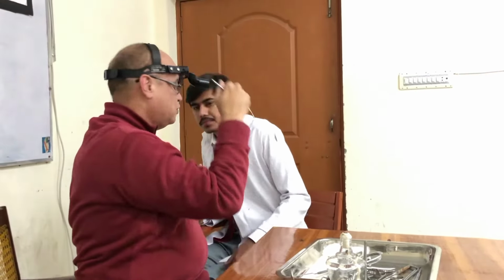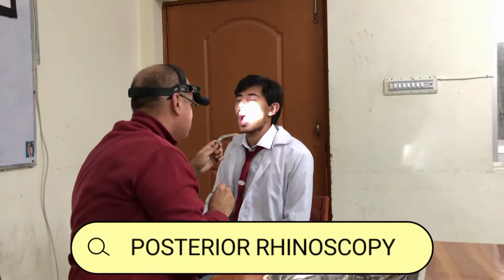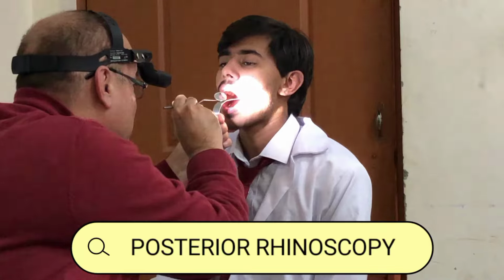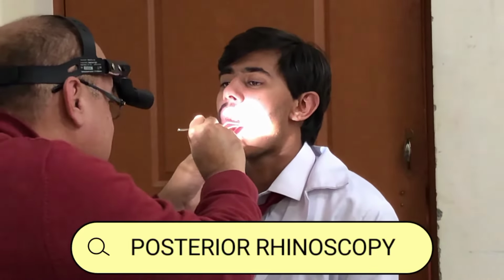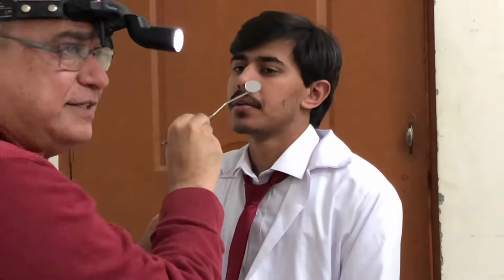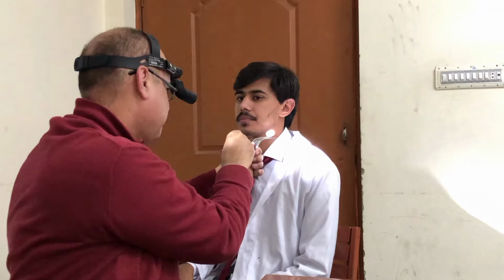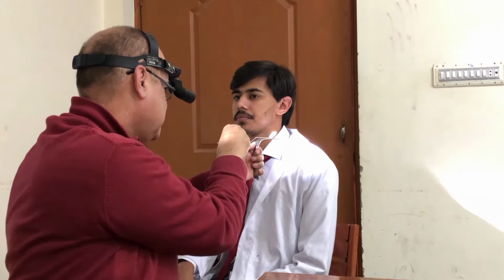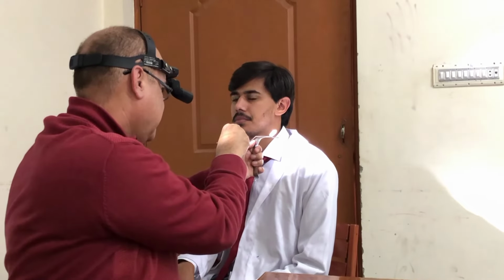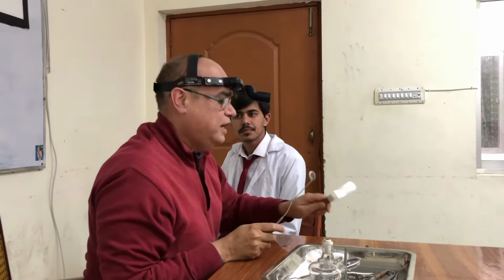So again, as I told you, you will go through the oral cavity. You will go over the tongue depressor and slide it behind the soft palate, and then your light will be reflecting from the mirror, and you can move the mirror to see the lateral wall of the nasopharynx, anterior wall and posterior wall. This is how you will go for examination of the nasopharynx.